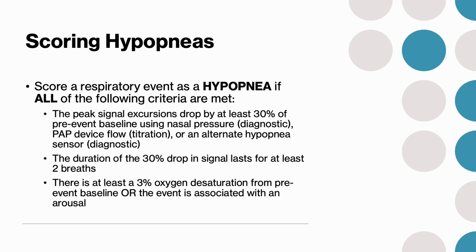Otherwise, you're free to score hypopneas with a desaturation of 3% or just an arousal. The manual did not used to have the 4% rule. That is strictly because Medicare has mandated it for their patients. And do you know what that means?